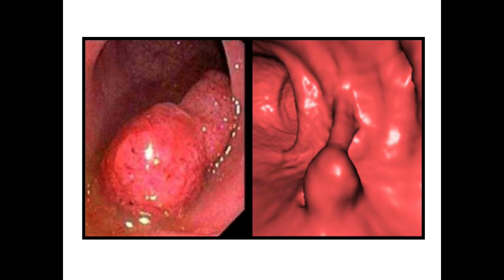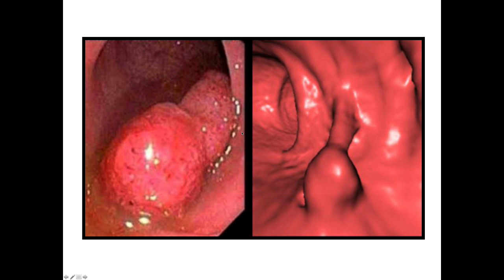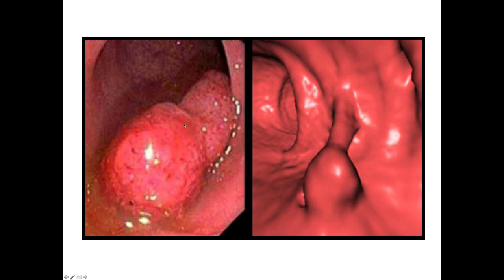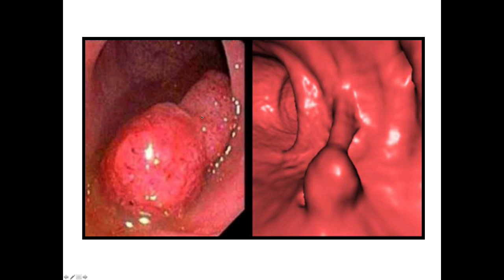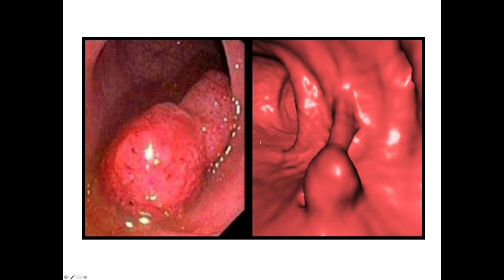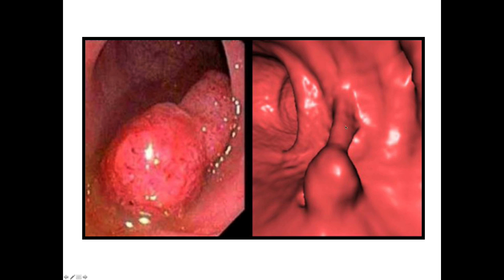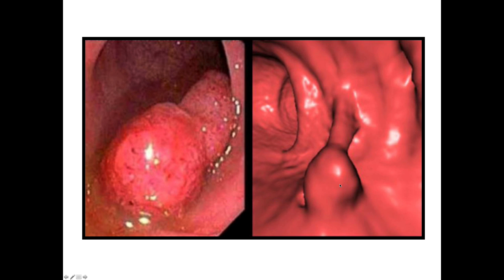Here's one example. On the left of the screen is a view on traditional or conventional optical colonoscopy. You can see there is a polyp situated on the colonic fold — there's a stalk going up and to the right. And this is the virtual colonoscopic view where you can also see the stalk and the polyp quite clearly.